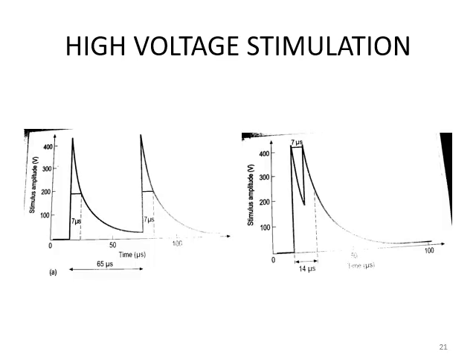As you can see in the images, there are two versions of high voltage pulse stimulation. On the left side, it can be seen that the twin peaks are present, but they have enough interval between them.